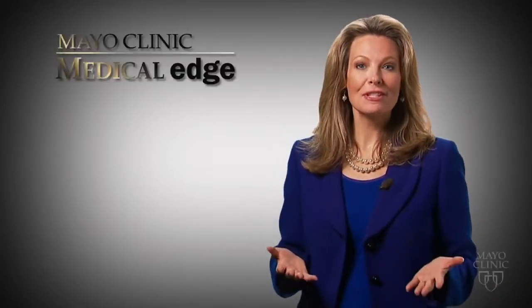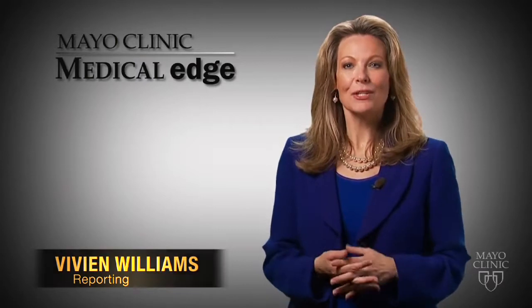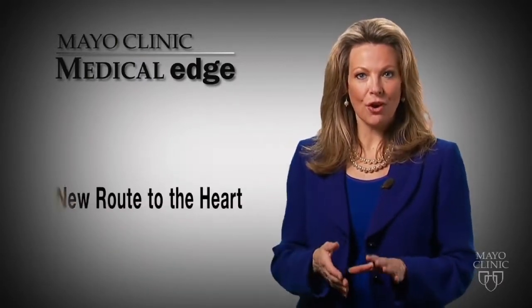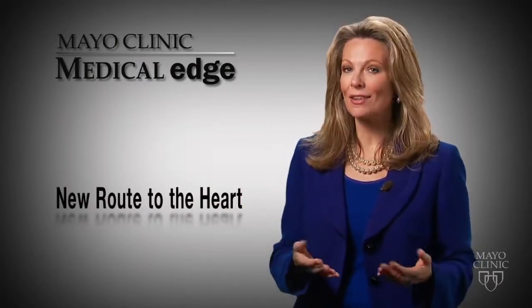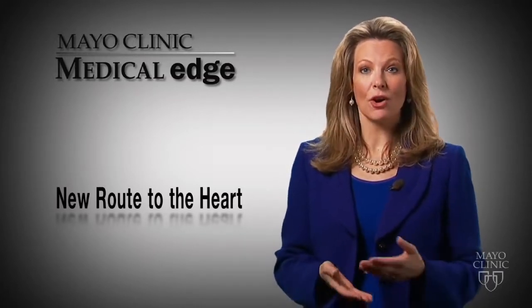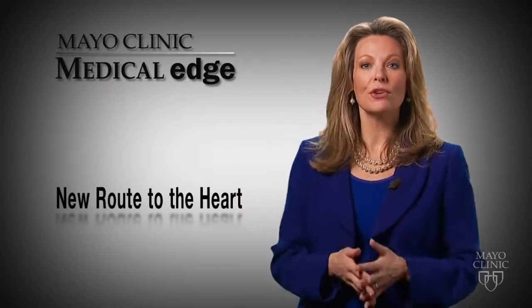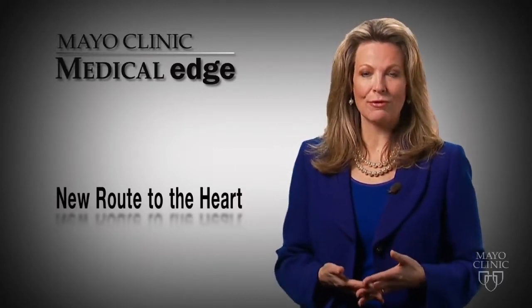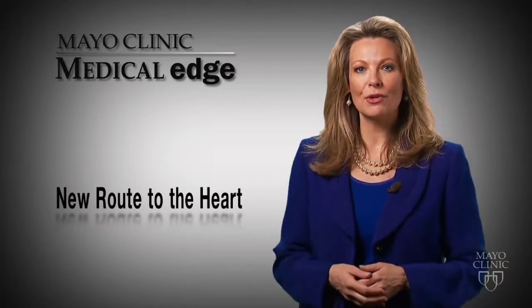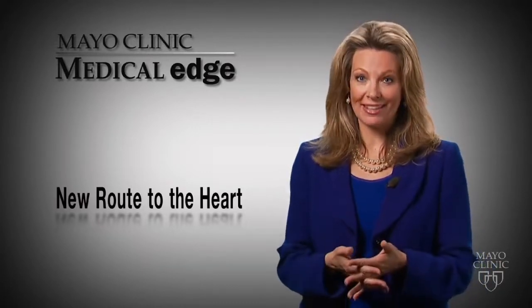Every year, thousands of people have cardiac catheterizations or angioplasties. That's when a doctor threads a catheter to your heart arteries to look for blockages and other issues. If they do see a blockage, they can decide if placing a stent to open it would be beneficial. For years, doctors have used the artery near your groin as an access point for this procedure. But now some are using the artery in your wrist. Why? Because it may be safer and easier on patients.